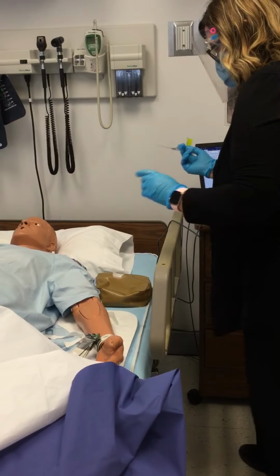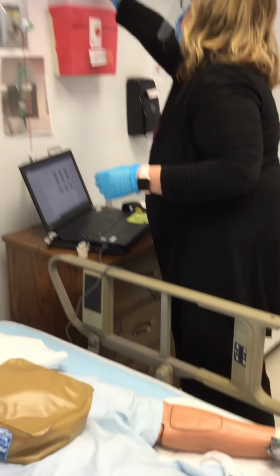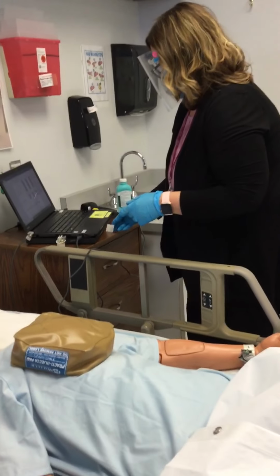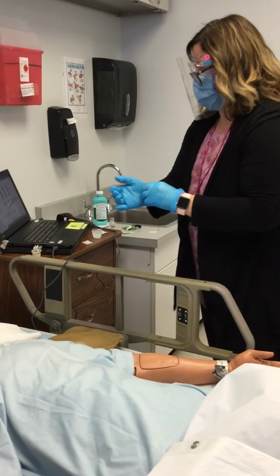So I'm going to Z-Track by displacing, and I'm going to dart, stabilize, aspirate, inject, and then when you let go of the tissue is when it would go back over. So less irritation. I'm going to flip the cap up, put it right in the sharps container. You can't recap or else that's an automatic fail.